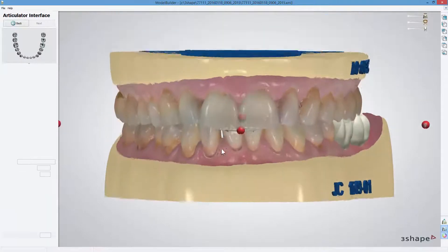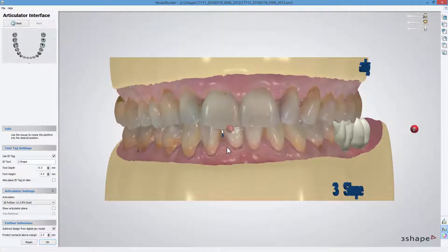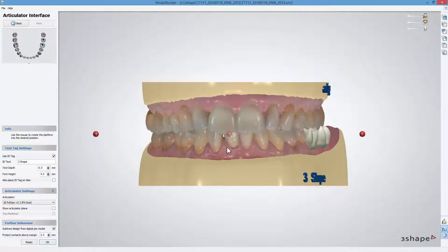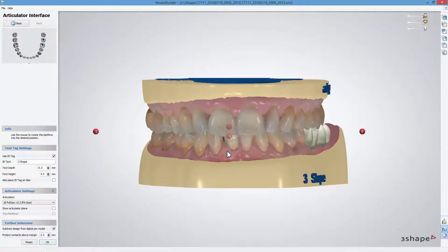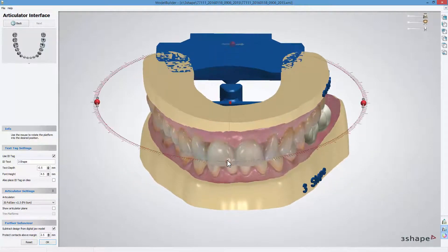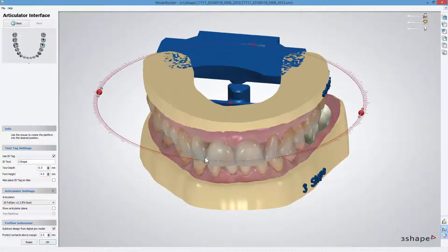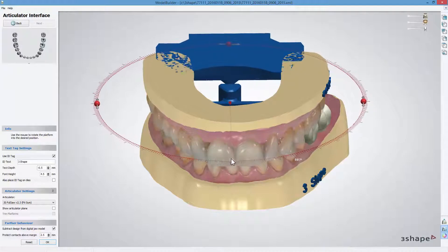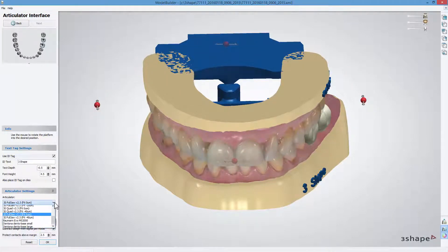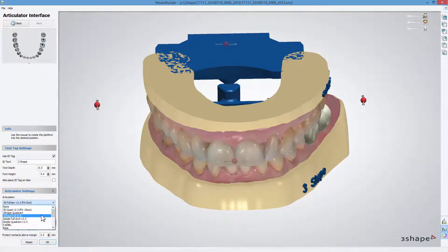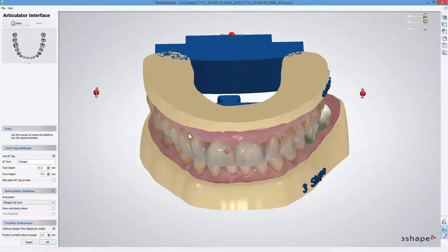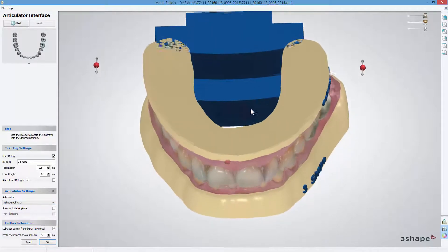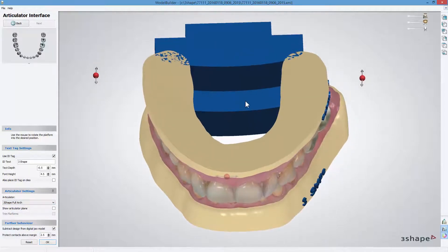Being in the Articulator Interface step, rotate the chosen articulator to set it into the desired position. You can always switch between any articulator models which are defined in the Dental System Control Panel.